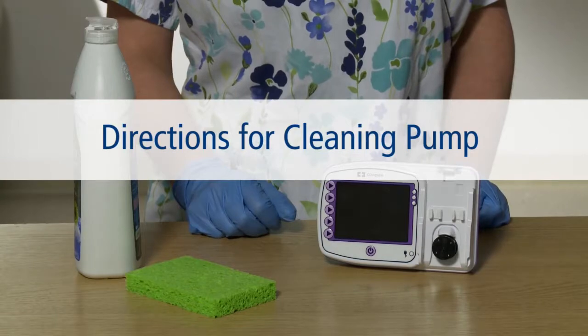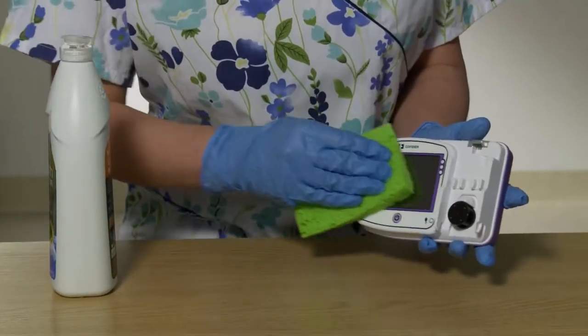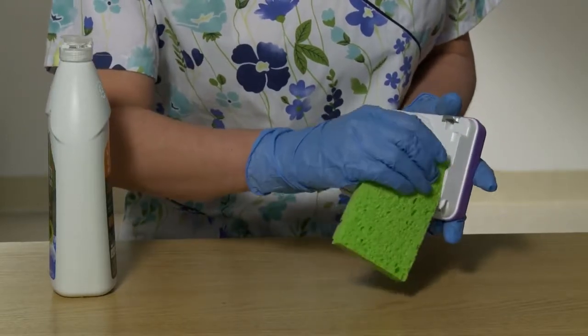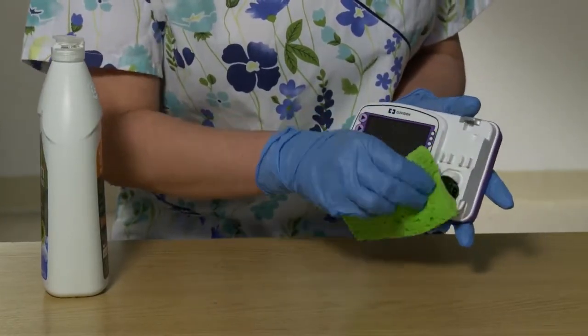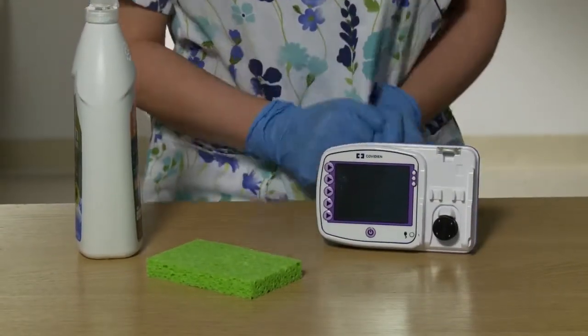Directions for cleaning the pump housing. Clean the outside surface with a damp cloth or sponge. For difficult to clean areas, it is permissible to wash the pump under running water. Avoid submerging the pump or washing with high-pressure nozzles.